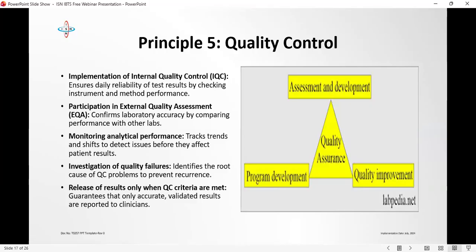So for those that can cause harm, like INR, like your cardiac markers, you need to have tighter control and measures on them, as opposed to the ones that don't really cause harm, like ESR, for instance, that you must put side by side with any other test before they are clinically significant. So you need to look into your lab processes and streamline your tests in order of priority and how they can cause risk to the lab. It is a requirement on control. Do you have a document of how your controls are run?